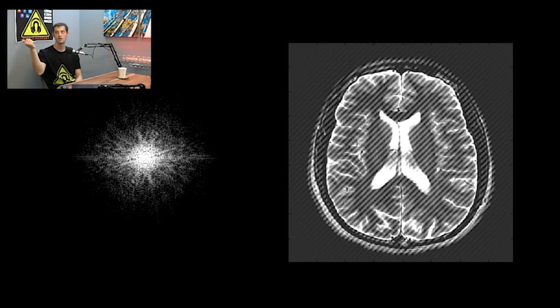So I put it at a middle distance and then it's there. Now where is the star, by the way? Is it upper left? It'd be upper left or lower right. An offset of approximately 4 centimeters to your left. Well, it's obviously in one of the corners. Which corner? Upper left, upper right, lower left, lower right. And remember, it's reflected, so it's either going to be left or right. Doesn't matter.